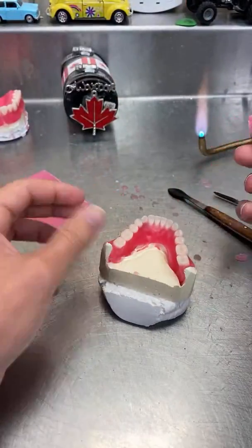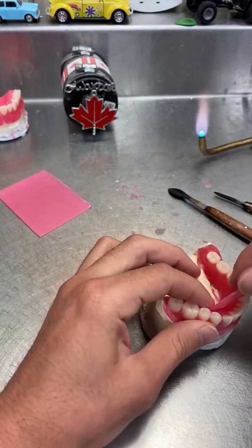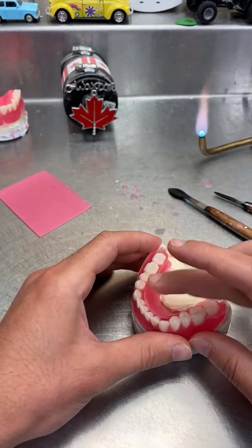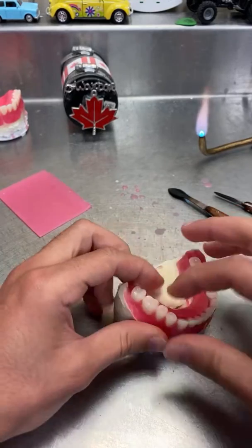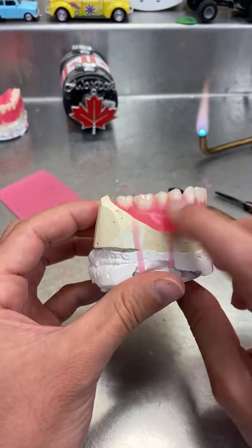Okay, now the lower, I think I need a little bit more here. The way that I actually set the teeth, I'm kind of waxing them as I set the teeth. And that's the thing that will make denture making fast and efficient. So you see here, I only set the teeth, but it looks like it's already been waxed.